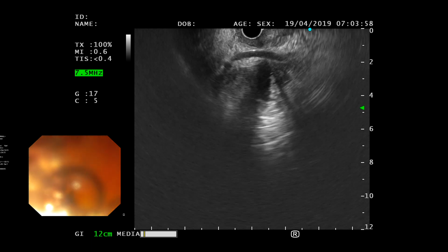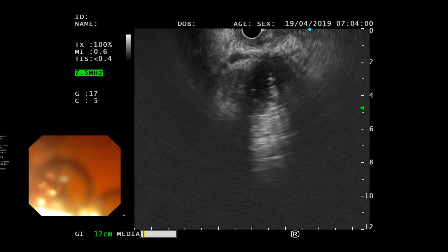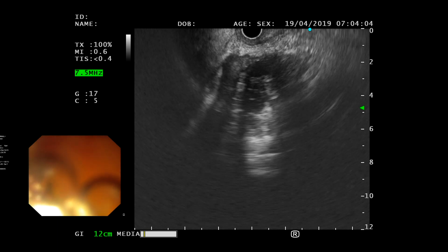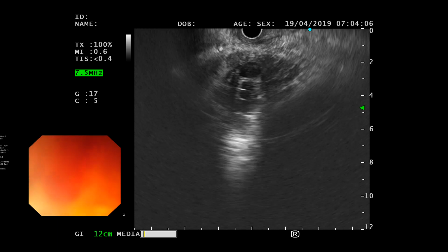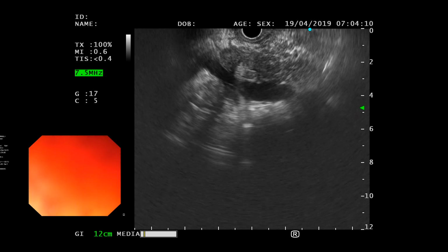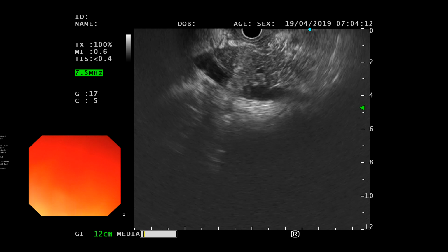Obviously, this is gastroduodenal artery. You have to avoid that. ये आप FNA के बीच में नहीं लेके आएंगे. ये आपका सारा जो वाइट मटेरियल है, this is basically stent, ये वाइट स्टेंट, हाँ उसका स्कैटर आ रहा है.